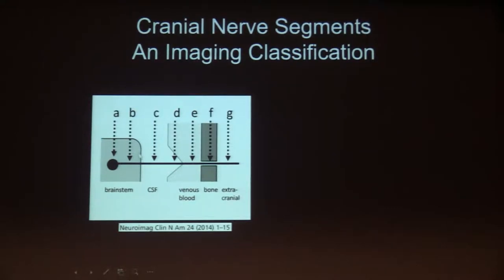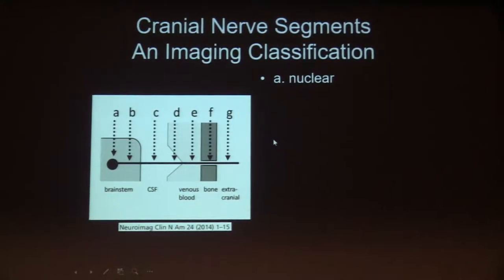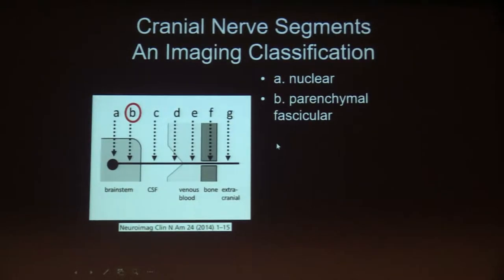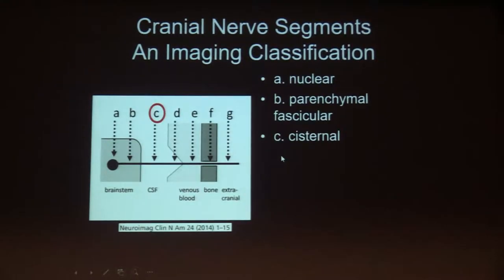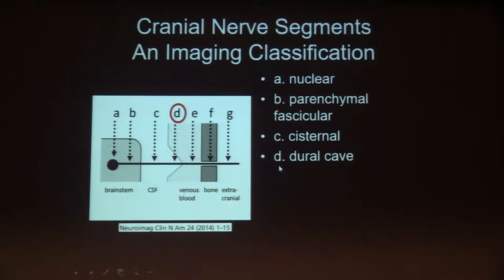We start with the A or nuclear segment, where the cranial nerve nuclei are in the brainstem. We have the B or parenchymal fascicular segment, where the nerve fibers extend toward the surface of the brainstem but have not yet left it. Then we have the C or cisternal segment, where the cranial nerves are surrounded by cerebral spinal fluid in the subarachnoid space.